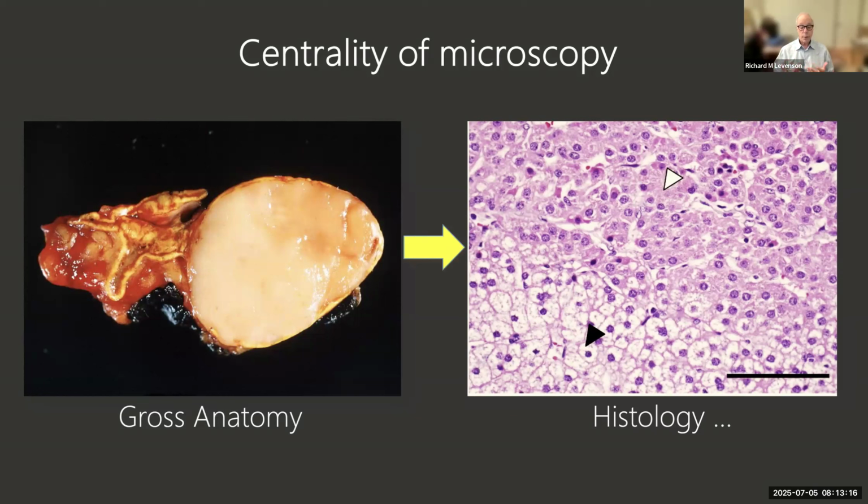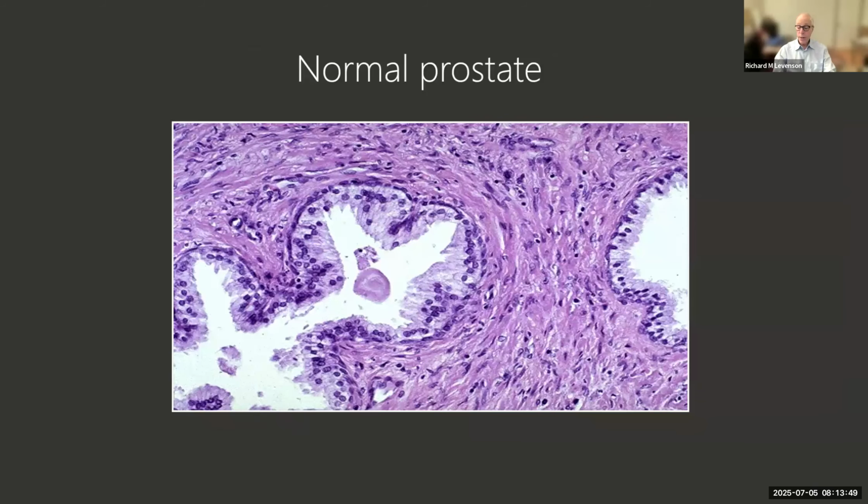What we pathologists do is look at images like this. What's going on here is that we're at the microscopic scale, where we're looking at individual cells and their relationship to one another. The little blue things are nuclei, the pink stuff is cytoplasm. There's a lot of fat down here because it's cleared out. You can actually make some decisions about what it is by looking at it at this scale. And now I will teach all of you to be pathologists in two slides.